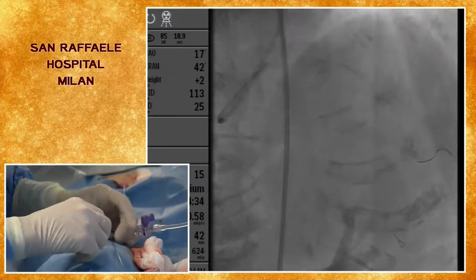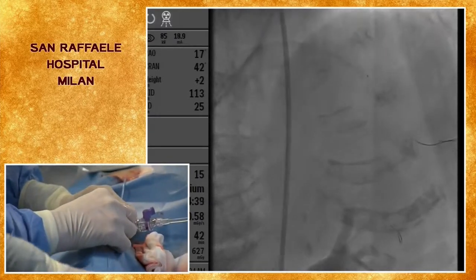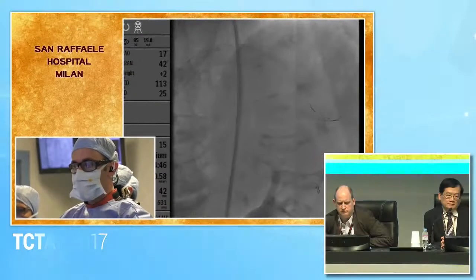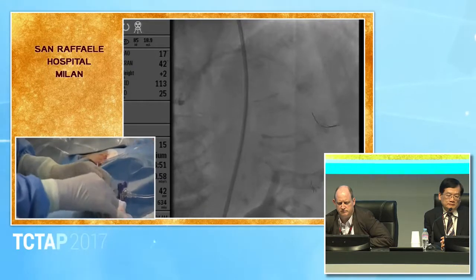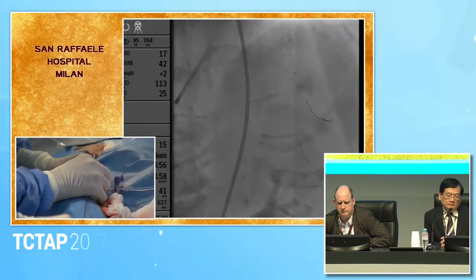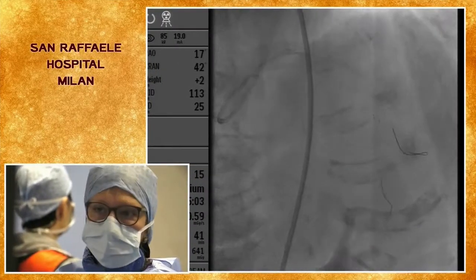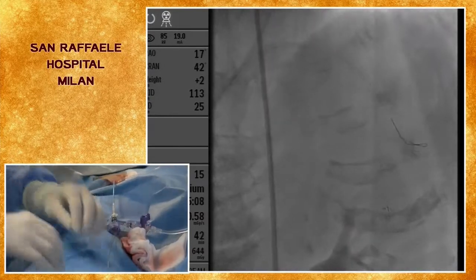So we are in a diagonal with a Grand Slam. Now hold. Let's get in with the guide. Now that we have a Grand Slam. Yeah. Okay, hold. Yes. Okay. Okay. It went. Salva? It went. You see how we jumped, but we did what we are supposed to do. Okay, we can Salva. Remove.